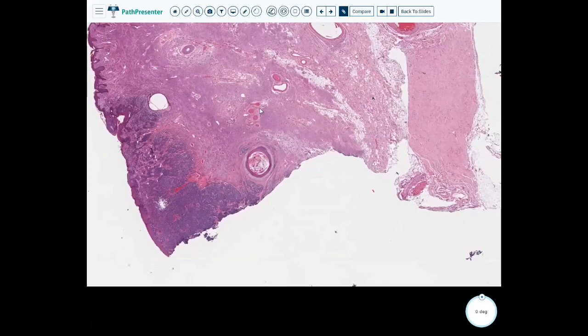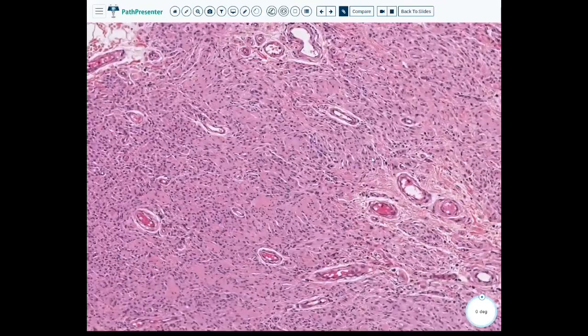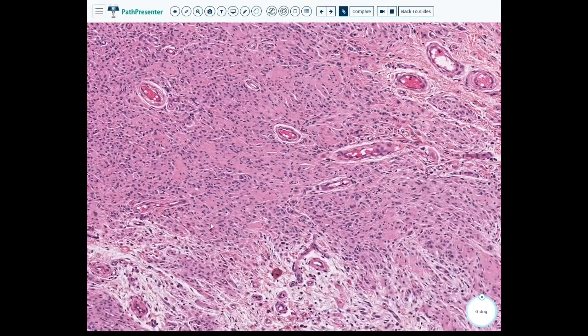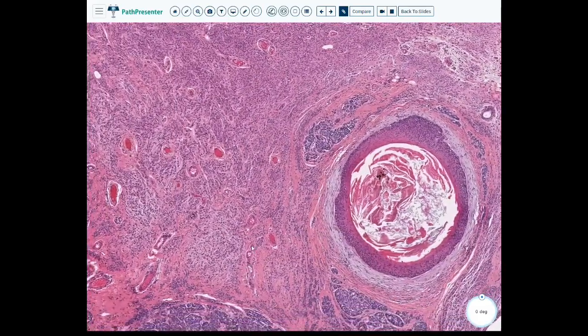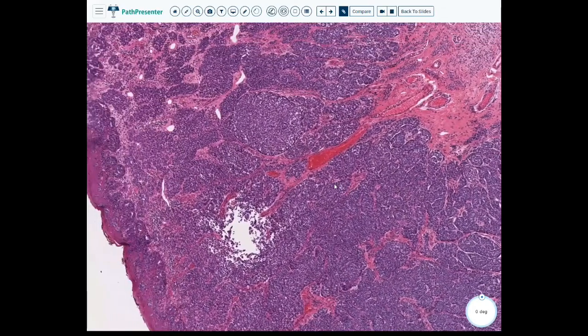So, okay, so we know that there's a component of congenital nevi, right? This is a congenital nevus. It's maturing, it's happy, it's underneath all these structures. Okay, so what's all this dark blue stuff, right? Because this was the stuff that really caught our eye.